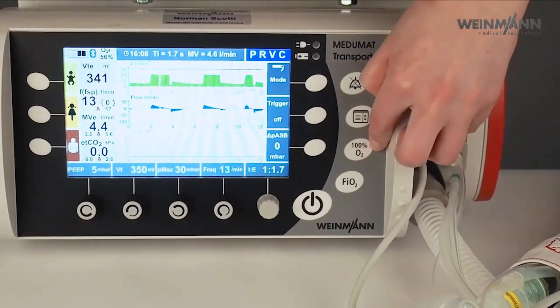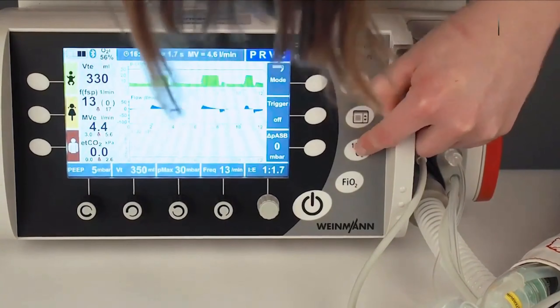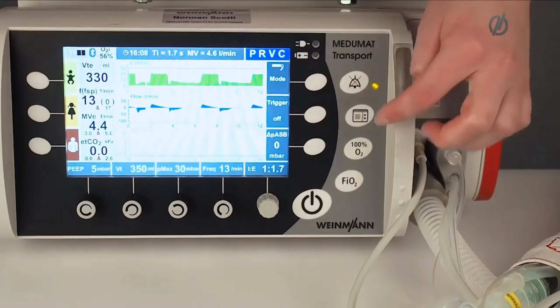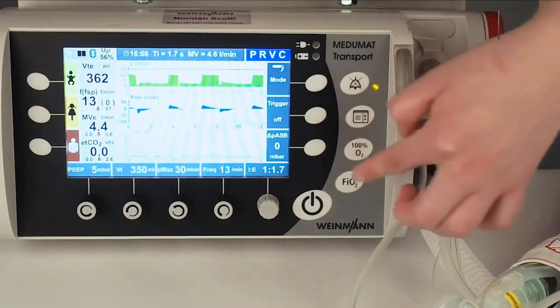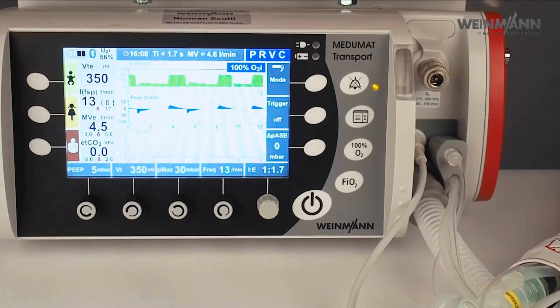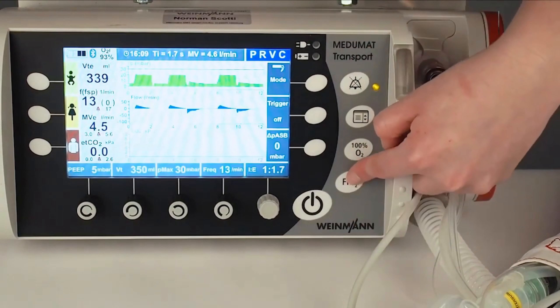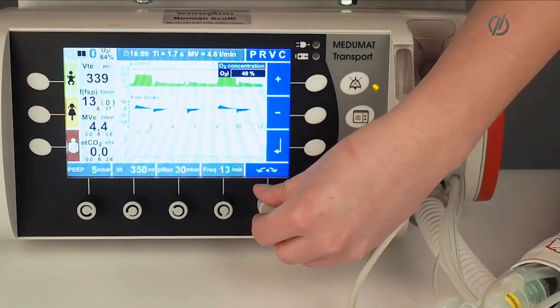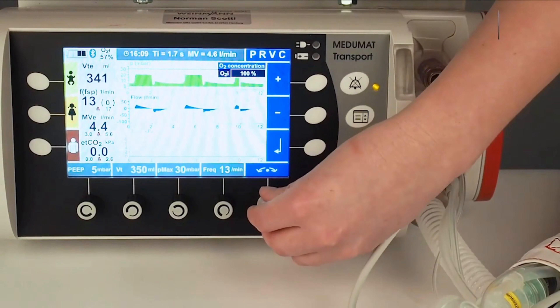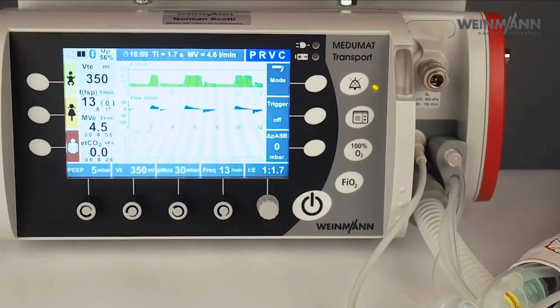Here I have the possibility to set 100% O2 for two minutes. With this button I can activate 100% O2 for two minutes. I can also change the FiO2 — currently at 40%, but I can change it from 40% up to 100%. I can see the measured oxygen concentration displayed on screen.